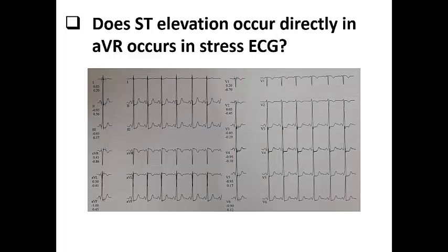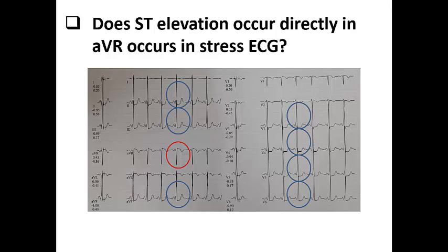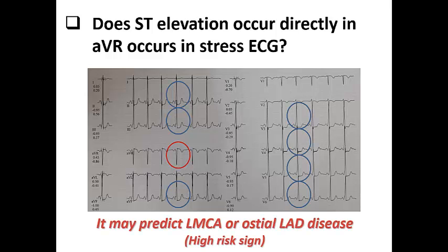Can ST elevation occur directly in AVR during a stress ECG? For example, during a treadmill test with acceleration of heart rate — can ST elevation develop in AVR like other ST changes? Looking at this ECG example, we see ST depression in inferolateral leads and ST elevation in AVR. This patient developed ST elevation in AVR during exercise, predicting left main coronary artery or osteal LAD disease. This should be regarded as a high-risk sign on a treadmill test, and the patient should be scheduled for invasive coronary angiography rather than medical treatment.